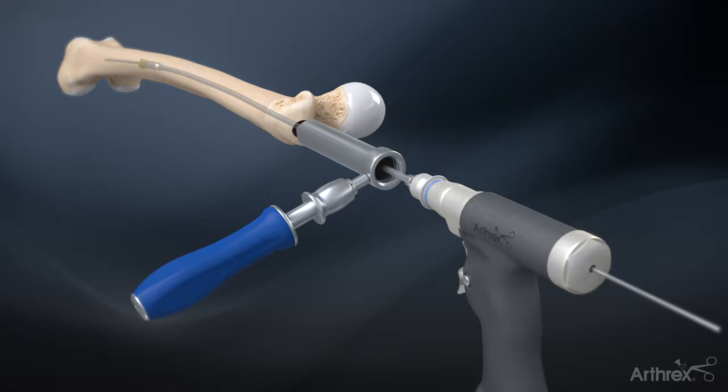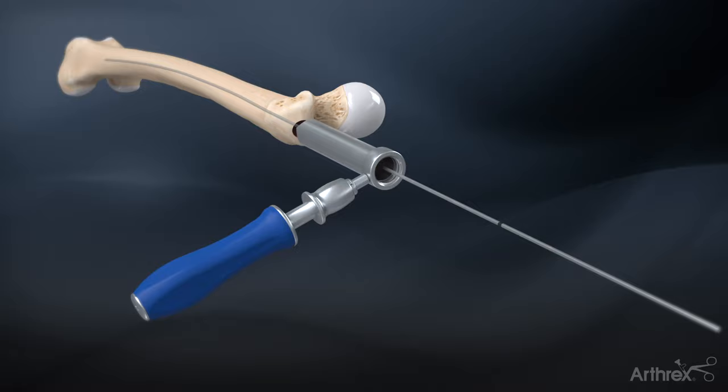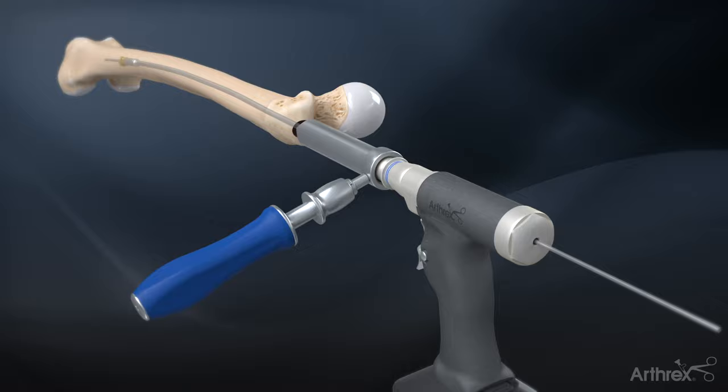The 8 mm end cutting reamer is used to ream out the central path for the nail. Progressively ream in diameter until cortical chatter is achieved.